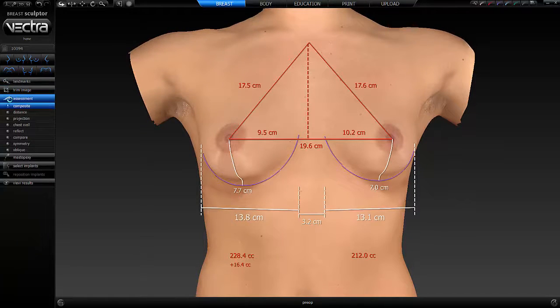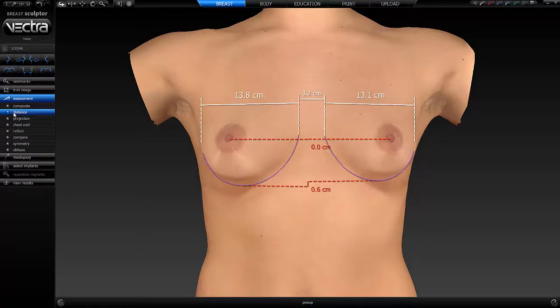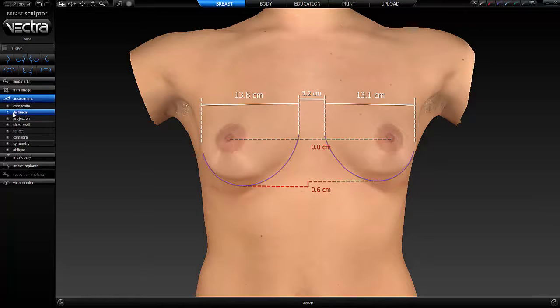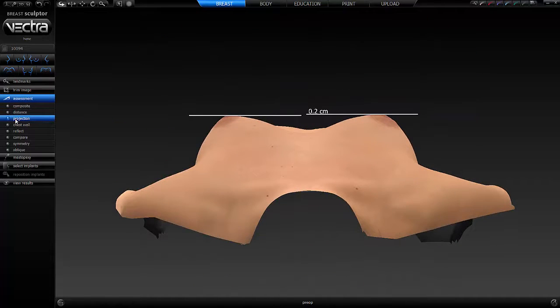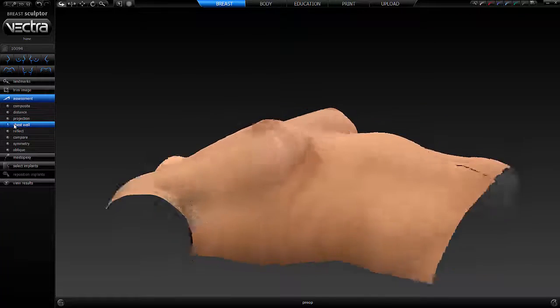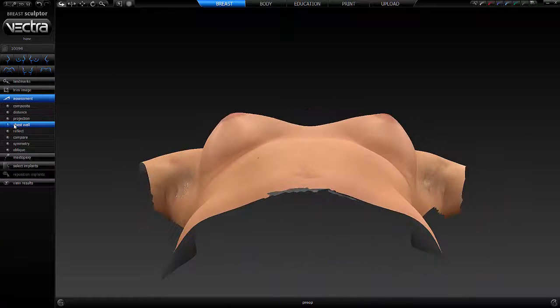The next step is to perform an assessment of the subject. Common measurements are automatically displayed, including estimations of breast volumes. The subject is viewed from above, and differences in breast projection are shown.